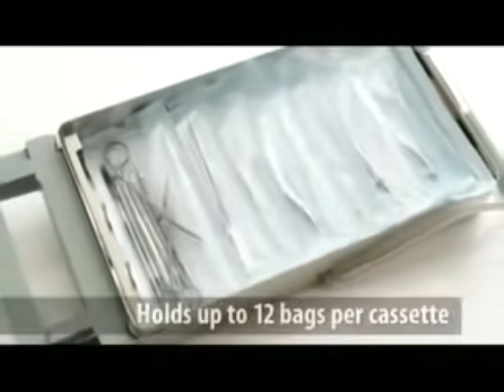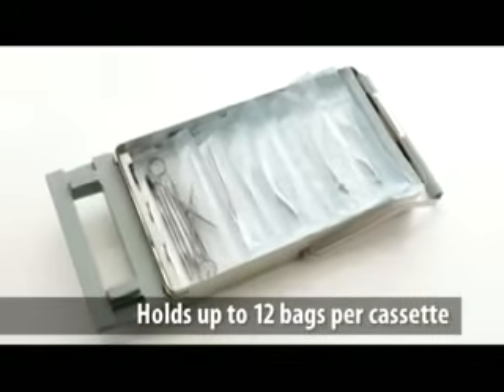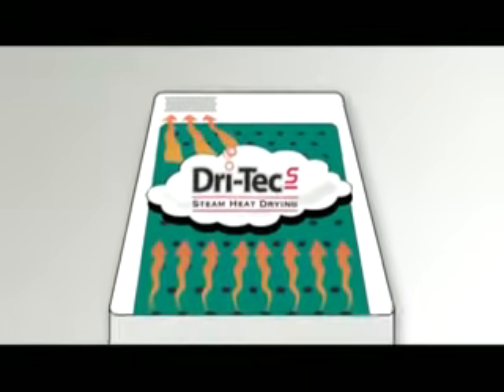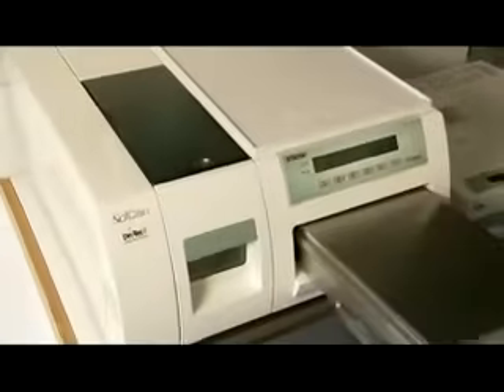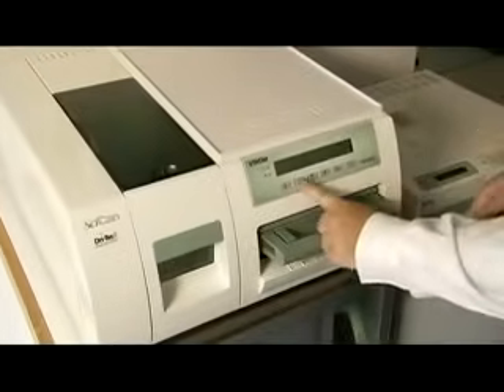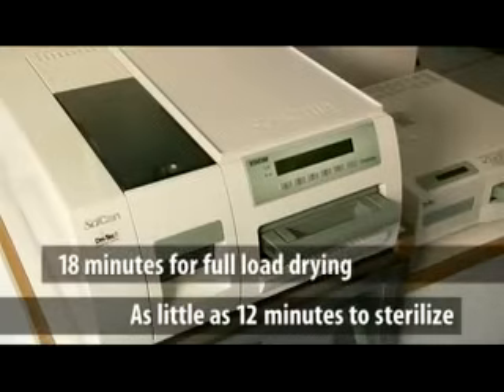The steam is forced through a separate integrated generator to increase the temperature. This superheated steam is used to dry bags after the sterilization cycle. Plus, it's easy to use. The Statum 7000 accommodates up to 12 bags. Please note the bags should not be stacked on top of one another. With DryTec S, the Statum 7000 provides superheated steam throughout the chamber. Conventional chamber autoclaves may take over an hour to sterilize and dry. DryTec S cuts that time in half, with as little as 12 minutes to sterilize and 18 minutes for superheated steam drying of a full load.